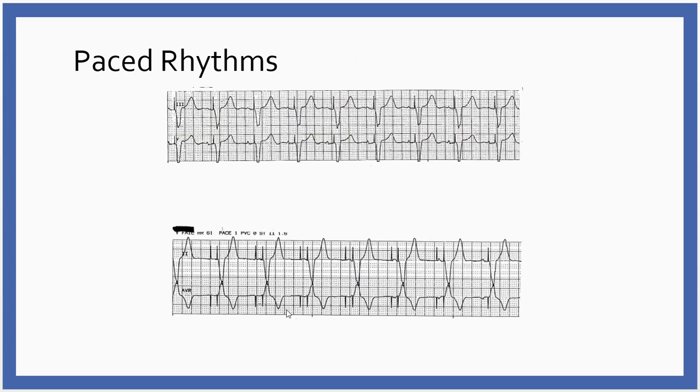Okay, moving past, this is the last thing we got to look at, and this is our paced rhythms. Now, in class or the recording, when we talk about pacemakers, I'll be talking about the pacemaker generator and patient teaching and all that other stuff. But if you've got a patient that's got a pacemaker and you put them on the monitor, the paced rhythms are going to look a little weird.